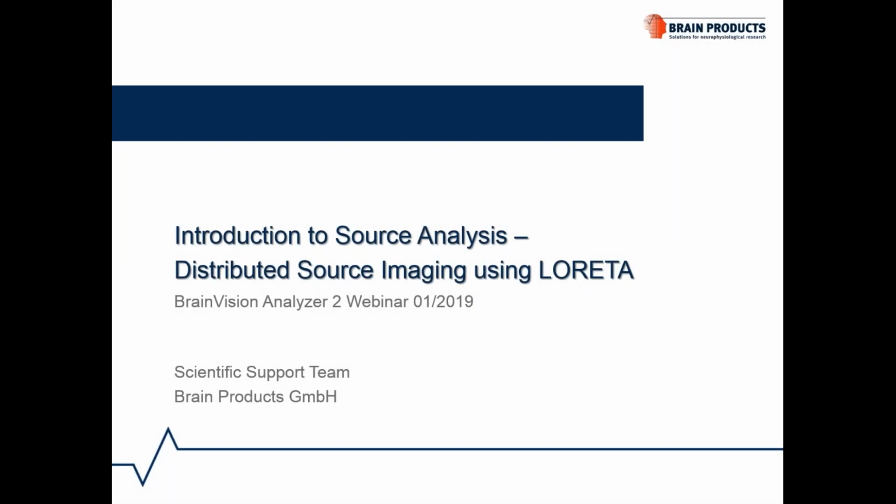As implied in the topic, it's going to be an introductory webinar on source analysis. You are about to grasp the basics of source analysis, mainly focusing on distributed source imaging using LORETA.